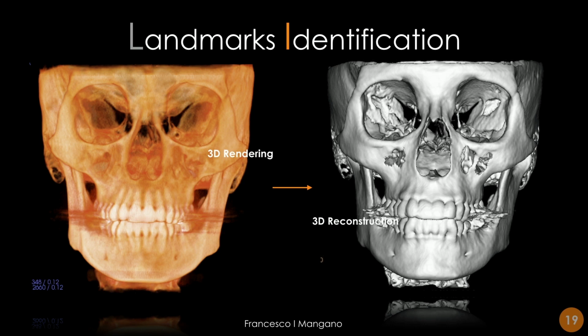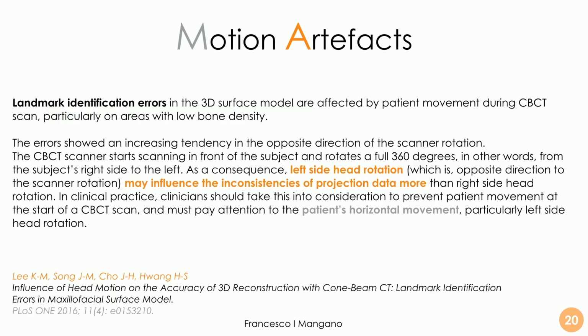Obviously, landmark identification is very important in oral and maxillofacial surgery, and also in implant surgery, and particularly with some specific applications like guided implant surgery, because we can have a problem.